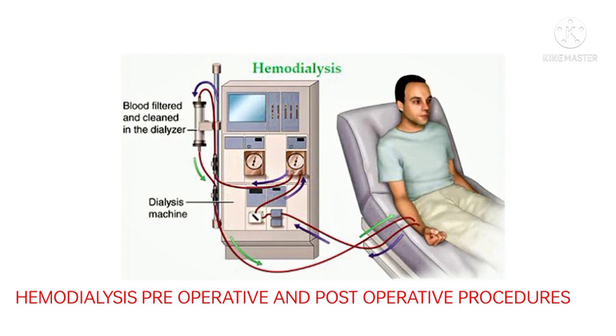One of the vital aspects of hemodialysis is the establishment and maintenance of adequate blood access. Without it, hemodialysis cannot be done. The major routes of access are central venous catheter for short-term access, and internal arteriovenous fistula and grafts for chronic dialysis.